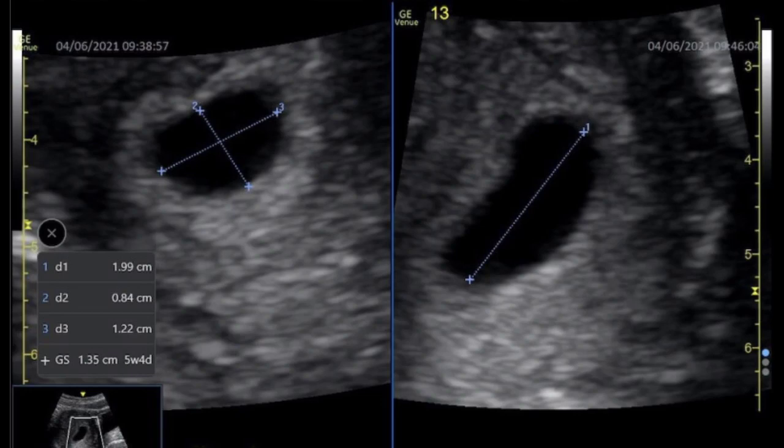Then, in the transverse plane at the level of the anteroposterior measurement, the width measurement is obtained. The three measurements are averaged to obtain the gestational sac mean diameter. In other words, the gestational age of the embryo is determined by measuring the mean diameter of the sac, as measured from inside wall to inside wall of the sac.